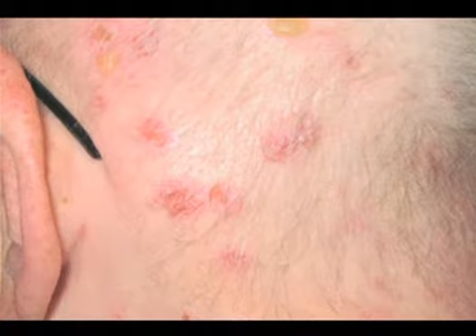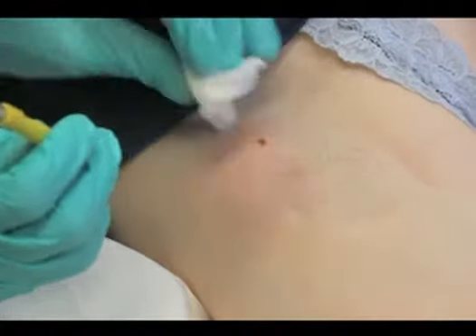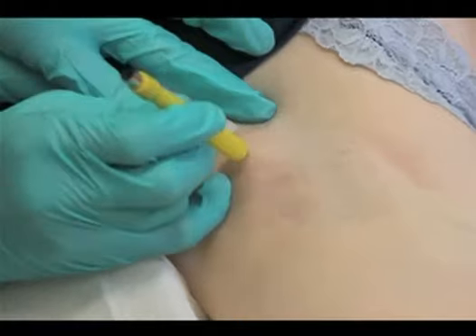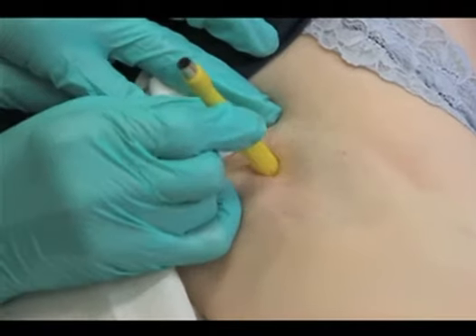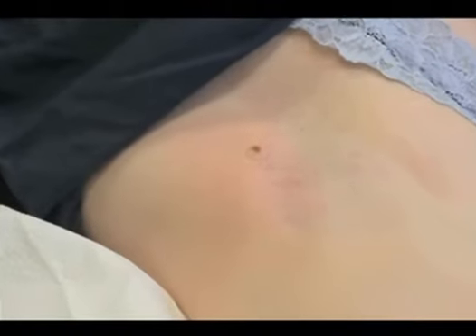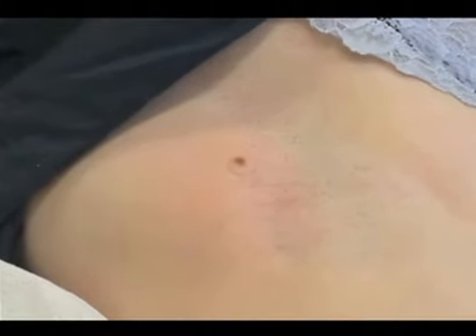To allow for the most complete sampling of pigmented lesions, it is useful to make an imprint around the lesion with the back of the punch before performing the biopsy. This imprint serves as a guide for centering the lesion in the punch. This initial imprint need not center on the lesion perfectly. The procedure is broken down into the following steps.